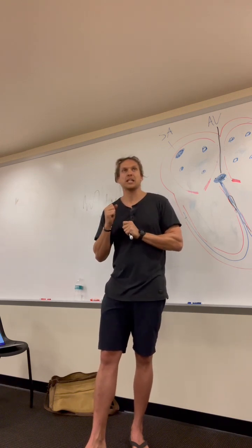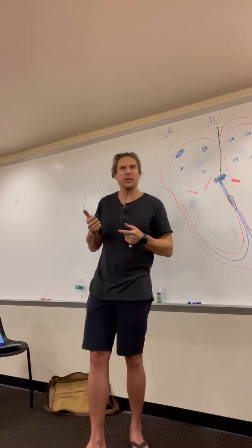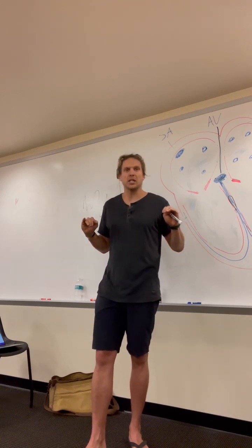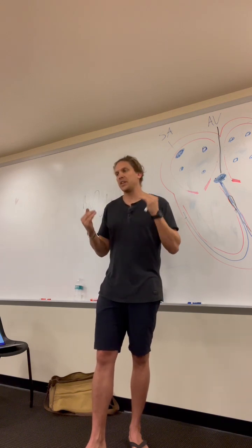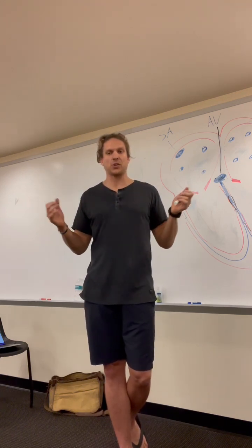Then you ask, is it irregular? Well, is there a pattern to that irregularity? That would be a regularly irregular rhythm. Or is it complete nonsense, as in the case of atrial fibrillation, where it's irregularly irregular. This is the only irregularly irregular rhythm that's in her slideshow.